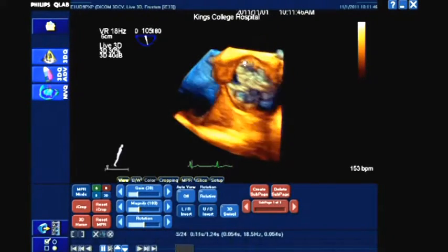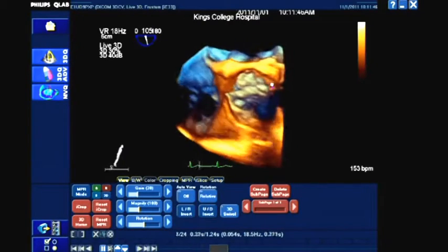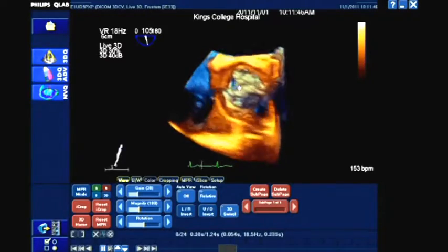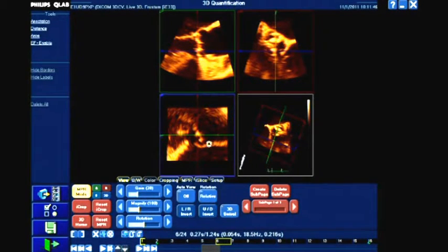Notice that there is some extensive calcification and narrowing of the aorta at the level of the sinotubular junction. We can see this ring of calcification, and we can see these very heavily calcified leaflets with poor mobility. But as before, for the annulus measurements, we're going to use the multiplane reconstruction. So let's step into that part of the software and again select our systolic frame, which I've just done now. Now, as it turns out, before we do anything else, we can see the origin of the right coronary artery very nicely on this image.